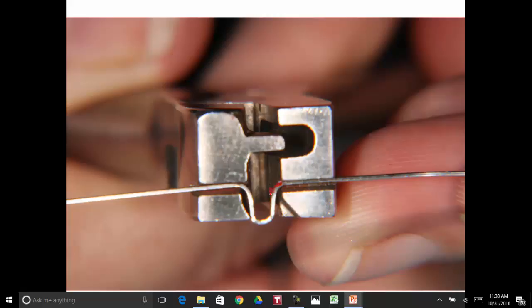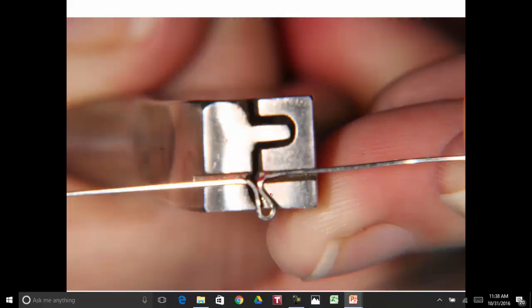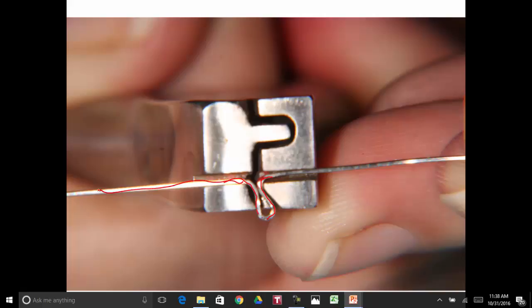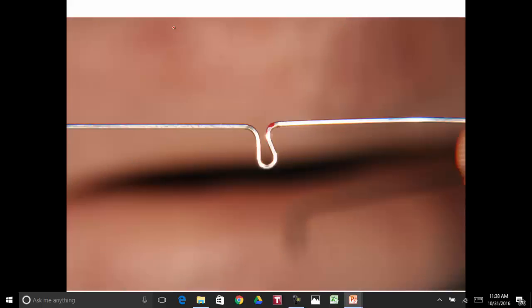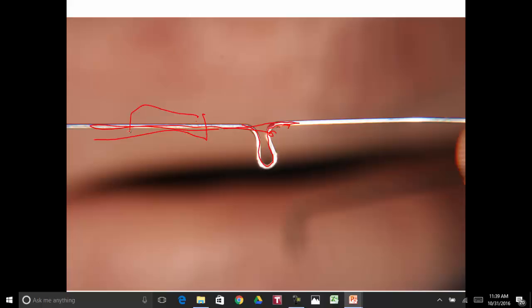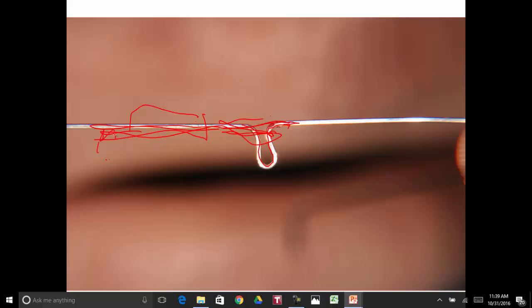Now, there's your mark that's on the wire. It closes here, and now the omega has a forward tilt like that. This is going to be the distal end of your archwire. This will go around to the other side. You'll have an omega on the same way on the other side of the mouth. There the omega is formed, and the archwire is in the same plane across here. This is a neat little omega, and you're going to push back on this. This will be the molar tube right here, and you push back to close space or tie the archwire back around the back of the molar tube right there.